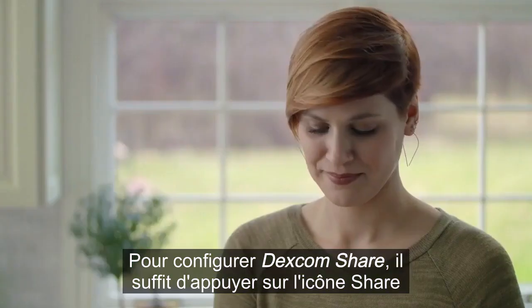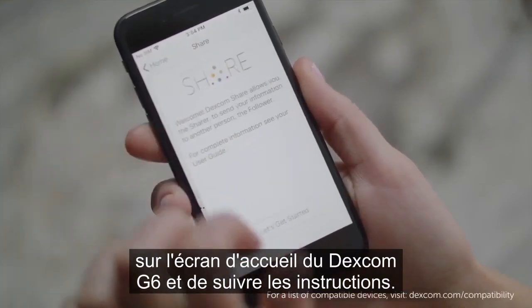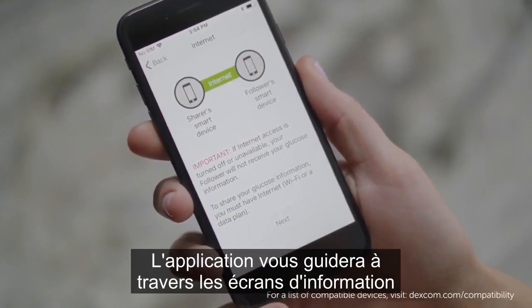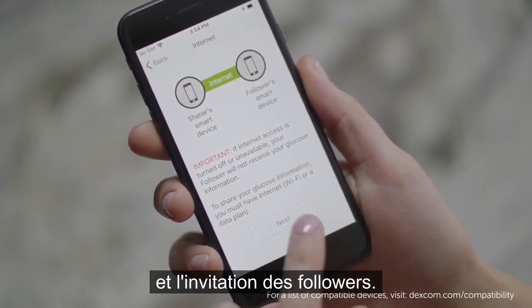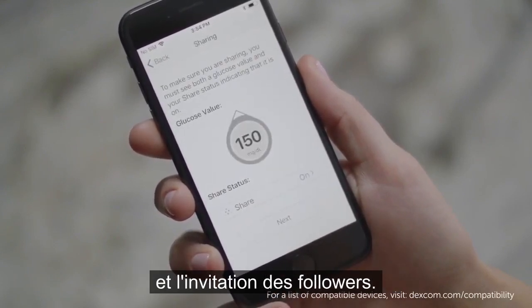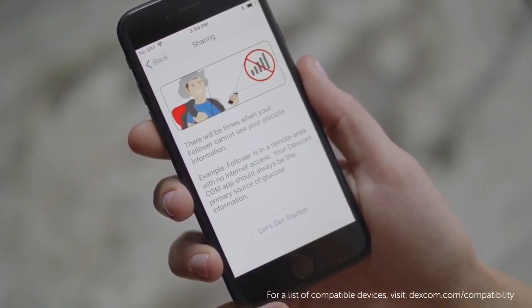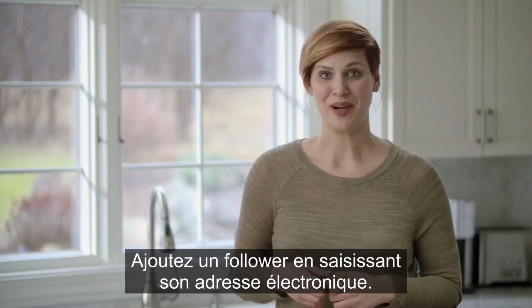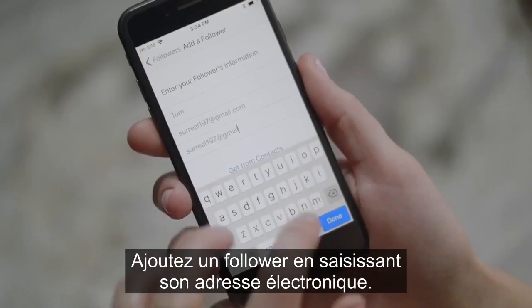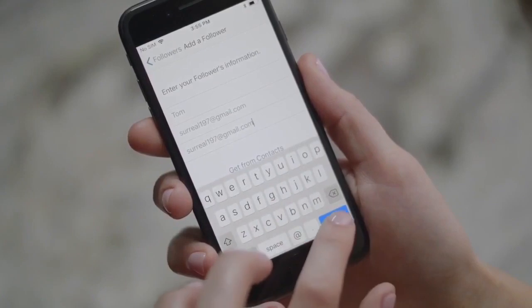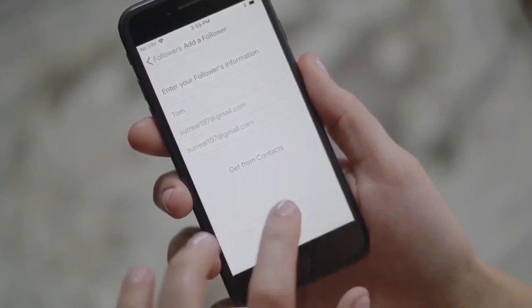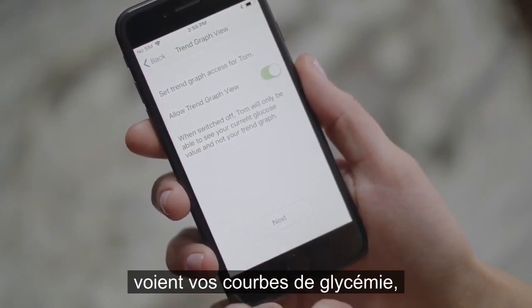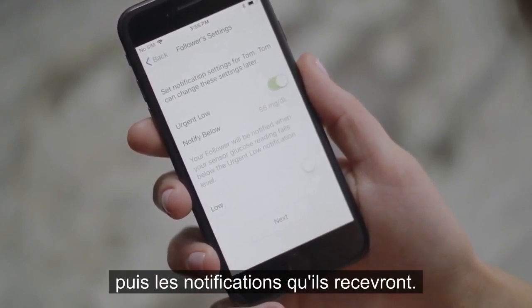To set up Dexcom Share, simply press the Share icon on the Dexcom G6 home screen and follow the instructions. The app will walk you through information screens and inviting followers. Add a follower by entering their email address, then choose follower settings. First, choose if you want your follower to see your trend graph. Then choose which notifications you want them to receive.